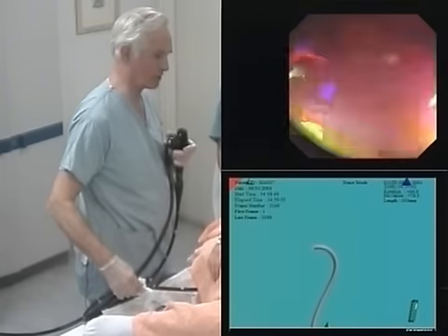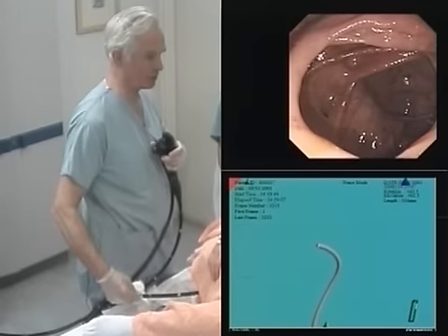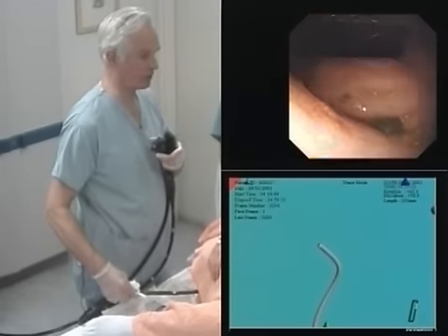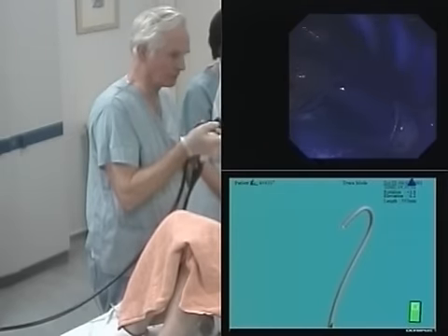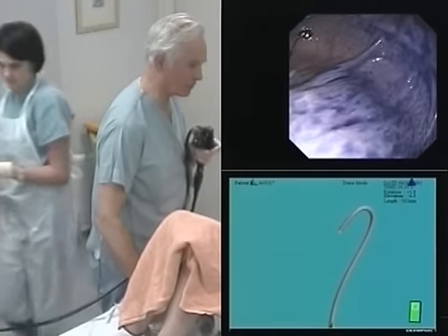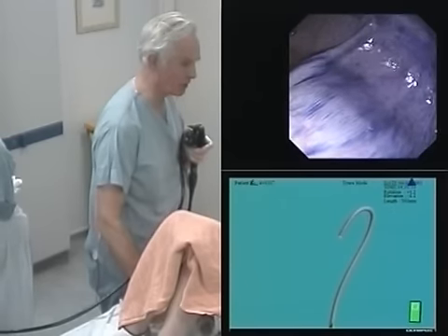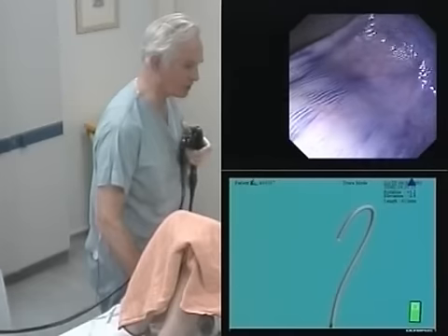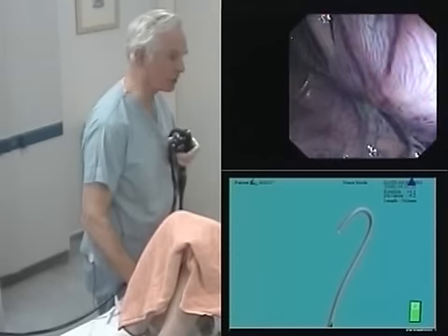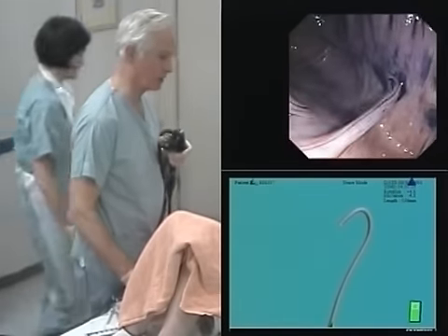So we're on the way back. It's gone terribly well, terribly good result. What I'm going to do is take a picture just to show that we got to the ileocecal valve. You can see the little whitish blips — those are the lymphoid tissue. There's one in the center of the screen now. But the main thing is, there's no question of there being any polyps. See the little grooves there? Those are like the fingerprints of the colon.